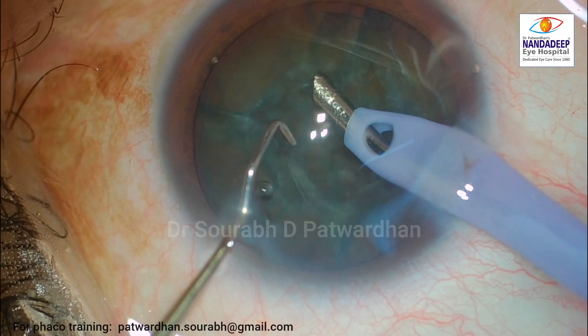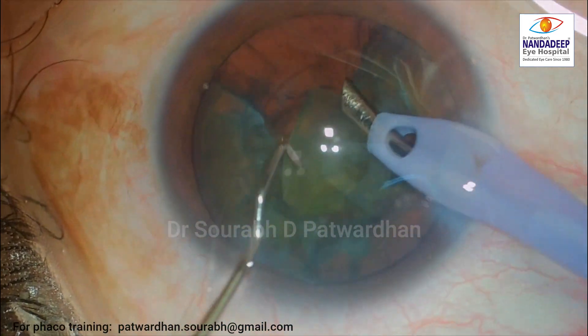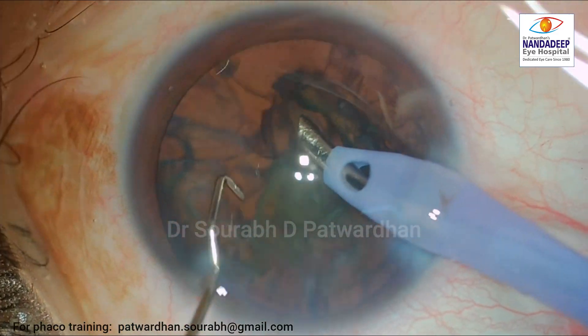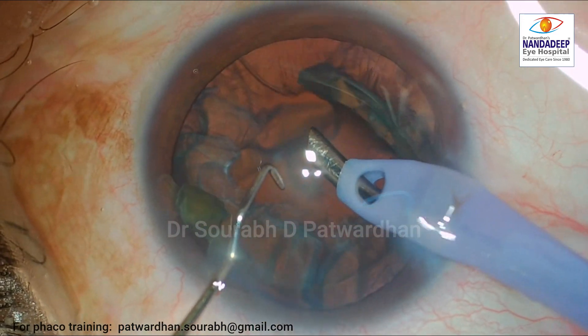The phacoemulsification part is quite uneventful, with no major events noted during the procedure. I proceed with the cortex aspiration.